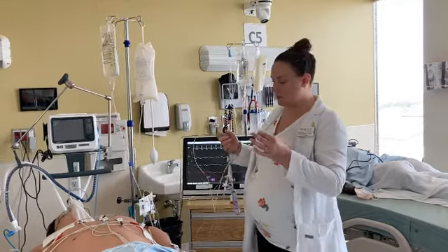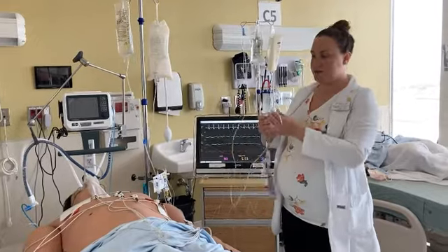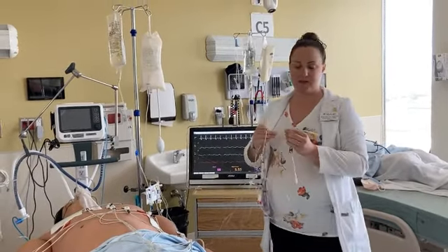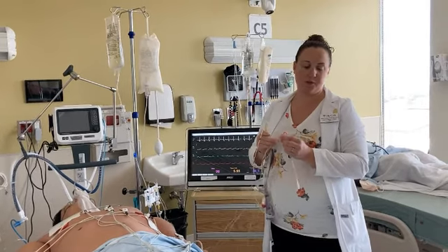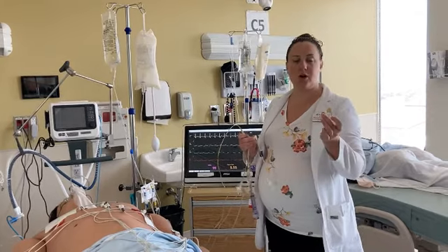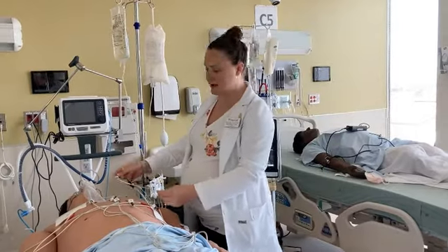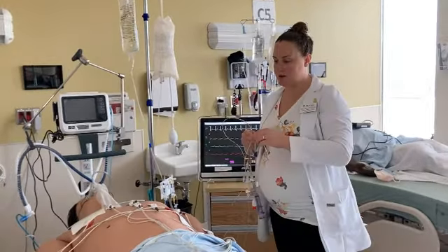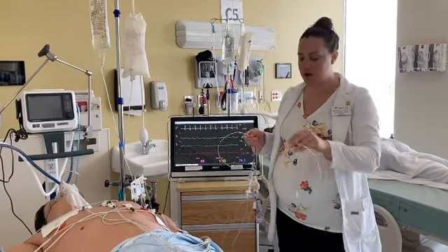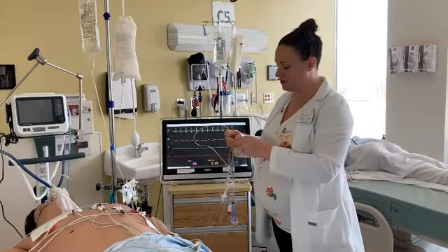So this is the setup that we would start with, and as you know, this pulmonary artery catheter, the yellow piece here, would insert into a central venous catheter called a Cordis, would be fished through, and this end piece would reach all the way into the pulmonary artery. So this would be located in the neck, in the jugular vein, and would, as I said, finish off in the pulmonary artery. I'm just going to take it out for the purpose of the demonstration.